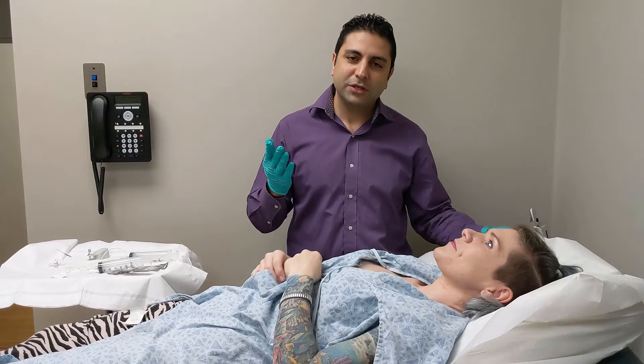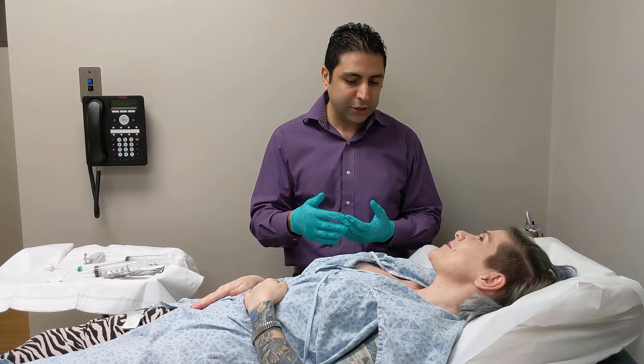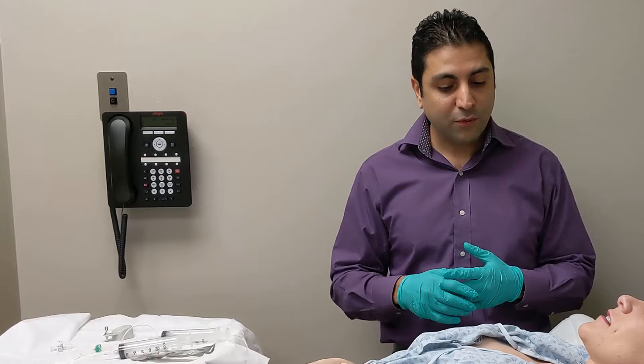She's going to come back and see me again next week. We're going to see how everything looks and continue the expansion process. Once we get to the full capacity of the breast expander, we're going to advance to letting everything settle and switch it out with a permanent implant.